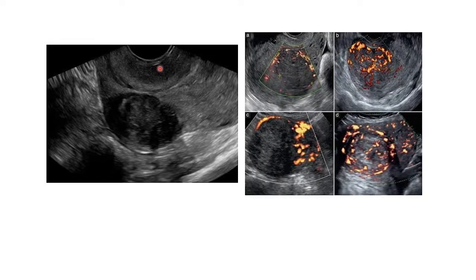So look here, that's our uterus there. You can see there's a fibroid there, and this is the canal there. That is the canal, that's the body of the uterus. So you can see here this is a subserosal fibroid. Fortunately, this type of fibroid you can easily see. Why? Because it is slightly hypoechoic as compared to the rest of the uterus. So this is hypoechoic. So this is a subserosal fibroid.